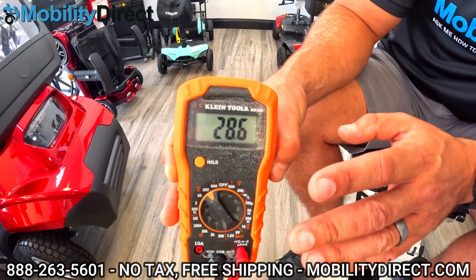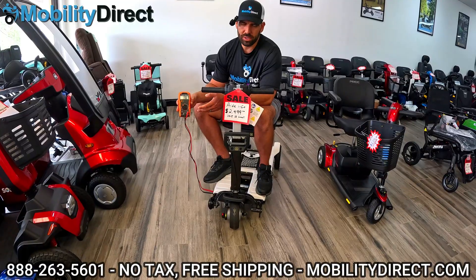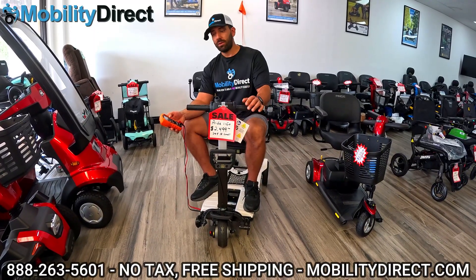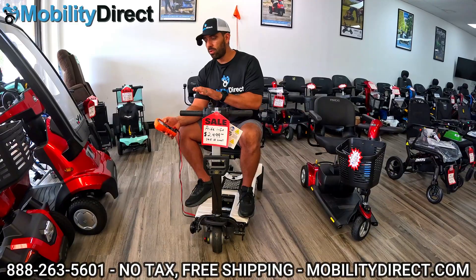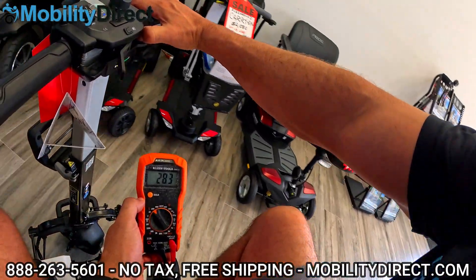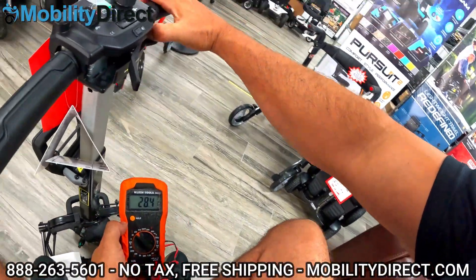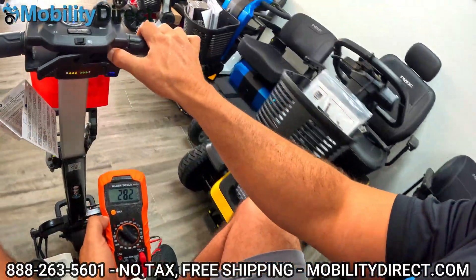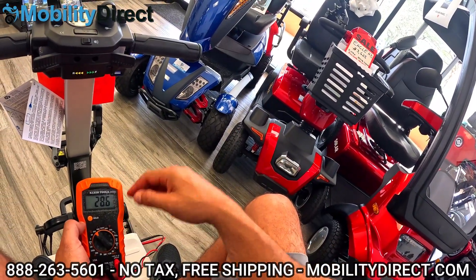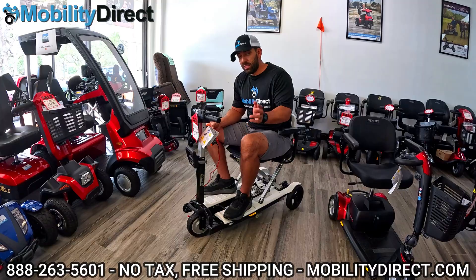We've had this scooter on the floor for a little while now, and it should hold a charge pretty well. We're going to test it under load the same way we just did. I'm going to turn the speed down and show you how far it drops from 28.6 at a resting position. We're at 28.6 at a standstill, and as we do a donut around the shop, with lithium batteries you typically get much better performance. It's going down barely any at all — 28.0 to 28.3 while cruising — and back to 28.6 at a standstill. The fact that it barely dropped at all after the load test tells me these batteries are in great shape.